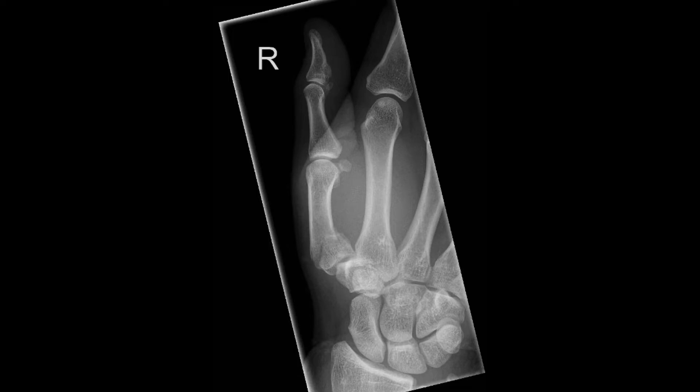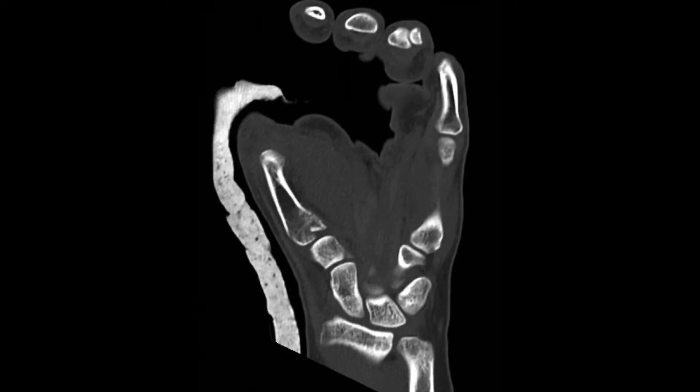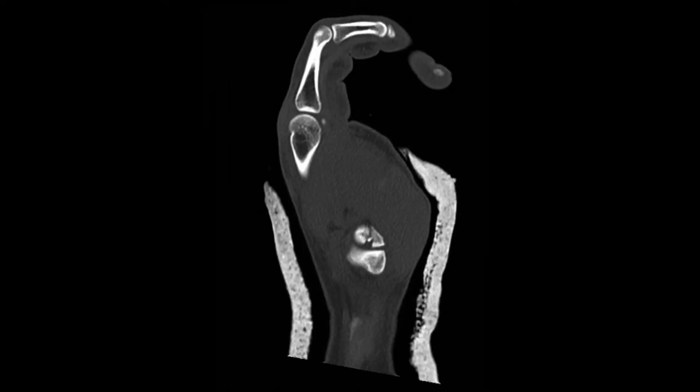This gentleman sustained this fracture playing rugby. The lateral thumb radiograph suggests it may be extra-articular, but the PA view shows it's actually a Bennett's fracture with a very large volar beak fragment. Due to concerns about comminution, a CT scan was done, which shows the extent of the gap and step in the articular surface, plus a small die punch fragment.